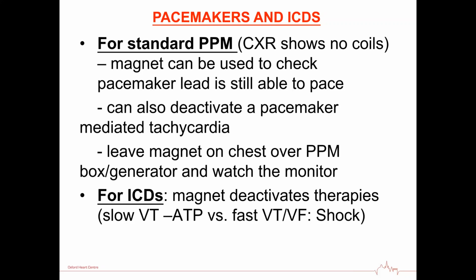Also, if they're coming in with a tachycardia, a tachyarrhythmia, and it appears to be a pacing spike before every one, if you do the same principle of putting the magnet over the box, it'll put the pacemaker back into a different mode and it should deactivate that pacemaker-mediated tachycardia. So it's got 2 benefits. It'll only work for that while you leave the magnet on the chest.